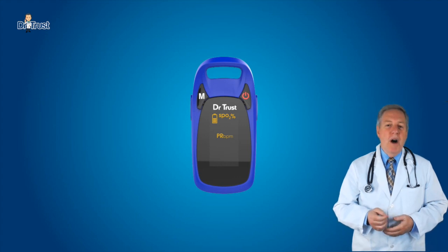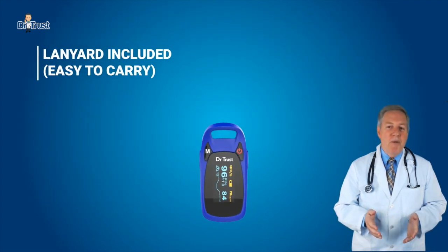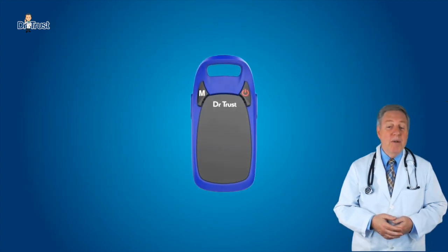The product will automatically be powered off if no finger is detected for more than 16 seconds. The product is lightweight for carrying and easy to use and comes with a lanyard. You can manually adjust the direction of the interface.